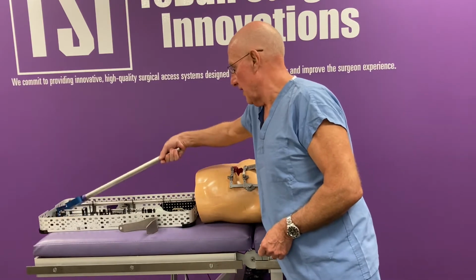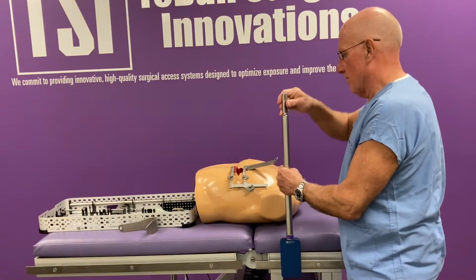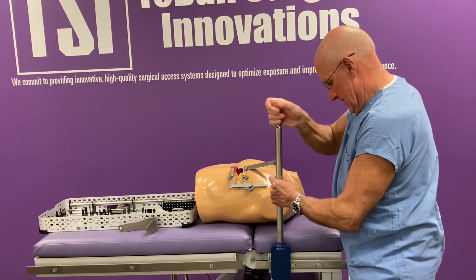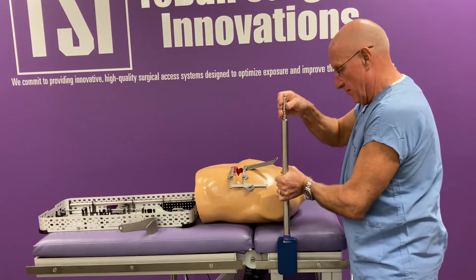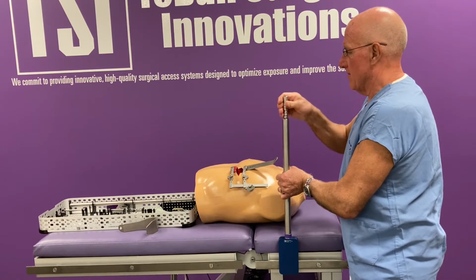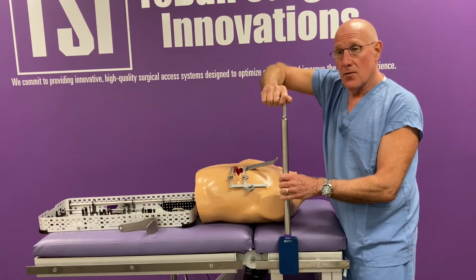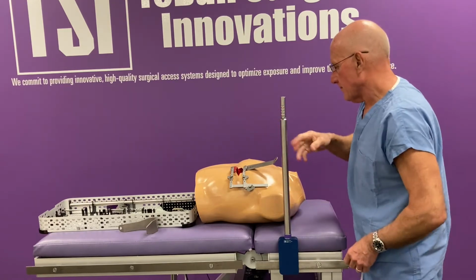So we'll start with the table arm here. We're going to mount this up towards the patient's neck. We're going to loosen this so that it fits over the table rail. We're going to mount it over the drape. And then once we get it tight by turning it clockwise, we're going to take this lever, which is going to allow us the torque to get it very stable.